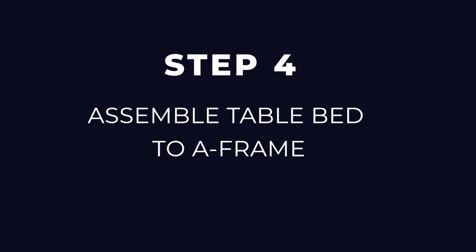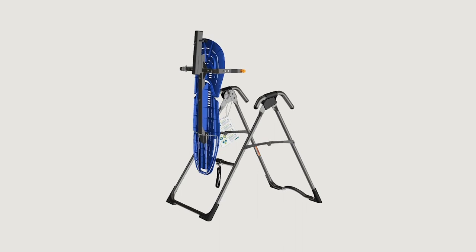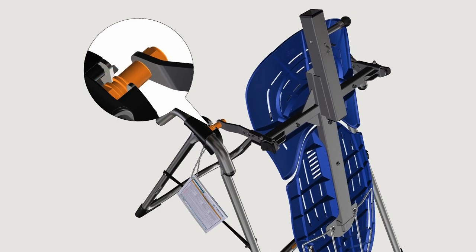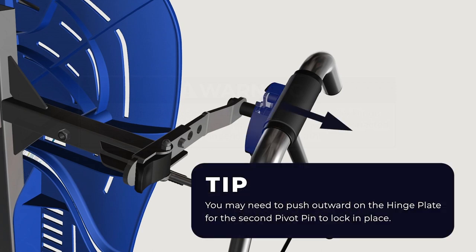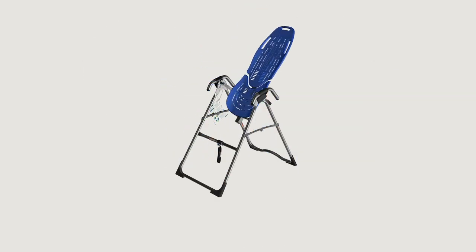Step four: assemble table bed to A-frame. Face the front of the A-frame where the crossbar is located. Grasp both roller hinges right above the cam lock and lift the table bed. Allow the top of the table bed to rotate toward the floor so that the back of the table bed is now facing you and the top of the table bed is in front of the crossbar. Lower each roller hinge pivot pin into the A-frame hinge plates one side at a time. The self-locking hooks will open to allow the pivot pin into the hinge plate slot, then automatically snap closed over the pivot pin. You may need to push outward on the hinge plate in order for the second pivot pin to lock in place. Make sure that each pivot pin is seated at the base of the slot in the hinge plates and that the self-locking hooks have closed over both pivot pins. Rotate the table bed so that it is facing up and ensure that it rotates smoothly.